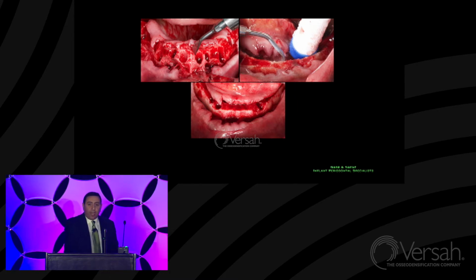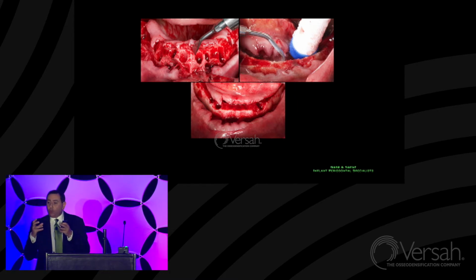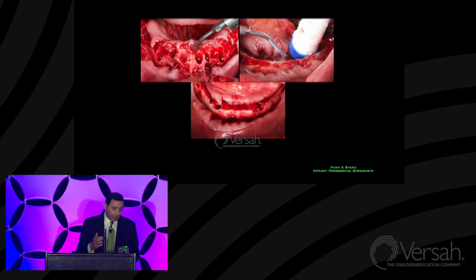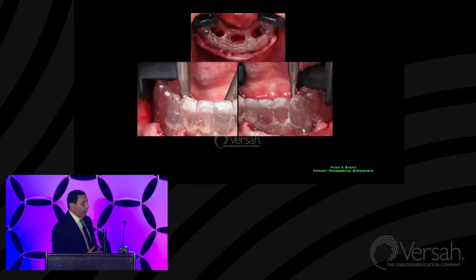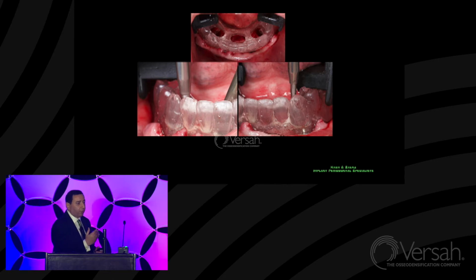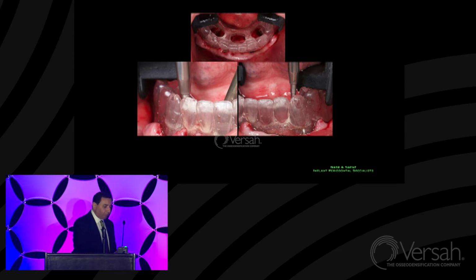We use our surgical guide, which is made as a duplicate from the denture that's going to be converted, so we know exactly where the occlusion is. The surgical guide provided by the prosthodontist in this case has pathways on the lingual, so I can see the position of the teeth and my emergence within the flange of the denture, and use it to make sure that I'm putting the implants in the position that would be restored. I can also see where the incisal edge is. So we start with that. We follow the protocol, place the implants, ideally, as much as we can, and proceed to the next step.